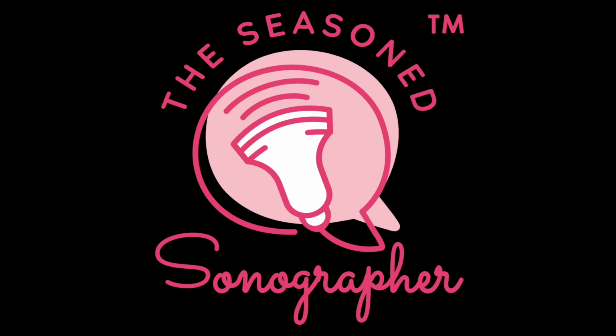You want to check for any free fluid that's suggestive of any rupture or hemorrhage. You want to evaluate for fibroids that could affect the pregnancy based on their location. Whenever I look at fibroids and see fibroids, I make sure to note in my report, the preliminary report, the location, subserosal, submucosal, or intramural, just so the provider has an idea of where they are and how they may affect the pregnancy.